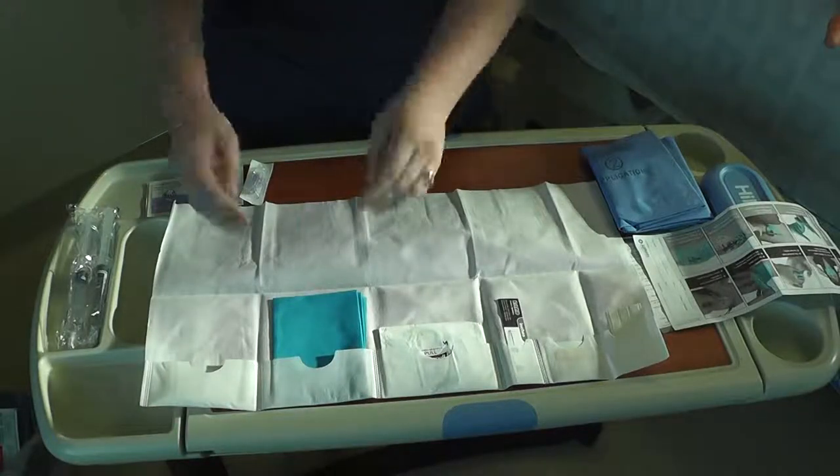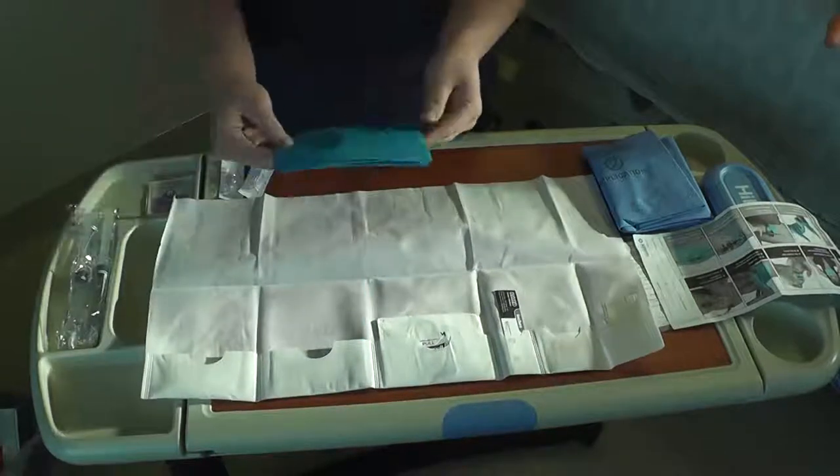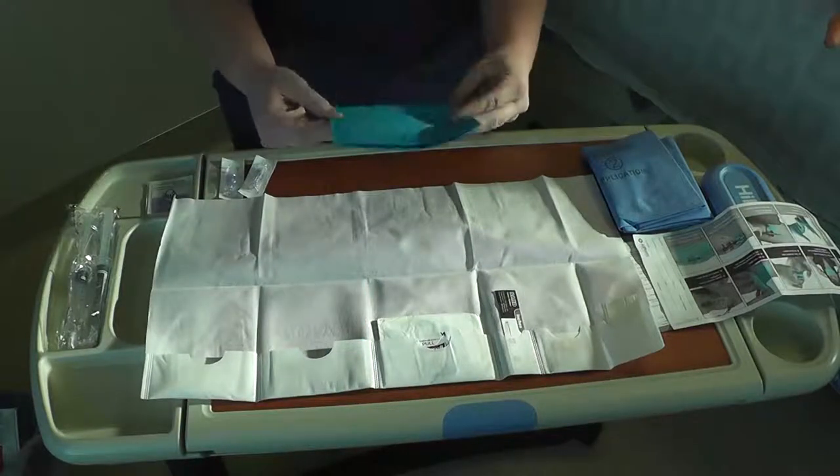Remove the drape, placing it under the arm of a patient with a PICC, or laying it on the chest, groin, or neck of a patient with a CVC.